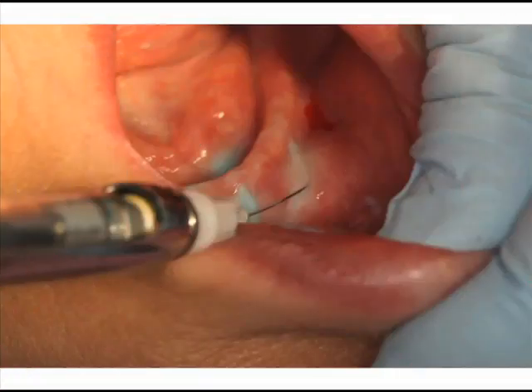Figure 10 demonstrates simple anesthesia to the area. We are simply infiltrating the surgical site. We are not doing any mandibular blocks, so the patient's tongue will not be numb, and the patient's lip will not be numb. We're really just anesthetizing the soft tissue over the bone. Bone is not necessarily innervated; nerves run through bone. So we have a safety device in that if we are close to any significant anatomy, such as the mental foramen, the patient will be able to respond to us and we can change our position.